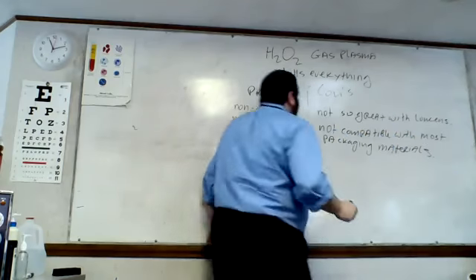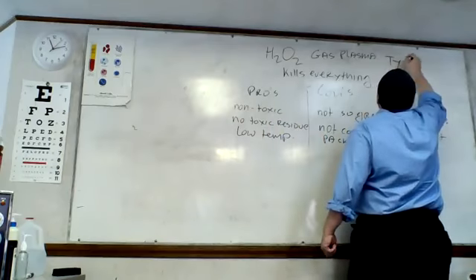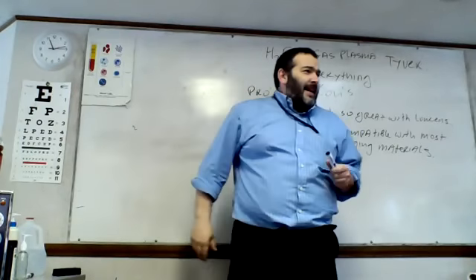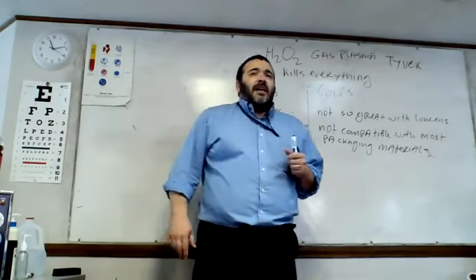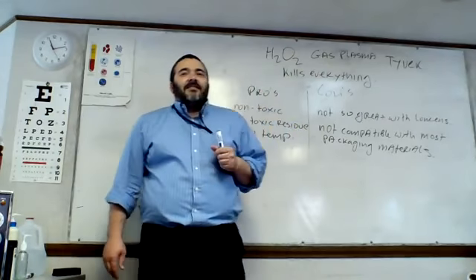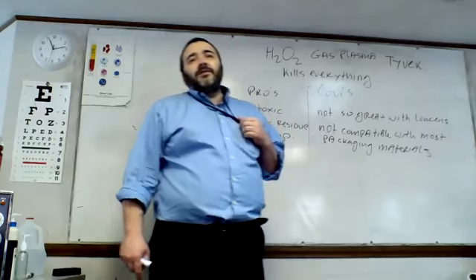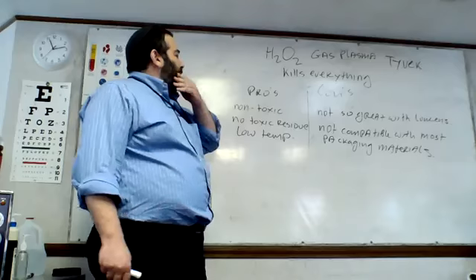In reality, the packaging material that it likes is something called Tyvek. You've seen houses being built, they wrap them up in this white material, it says Tyvek, Tyvek, Tyvek. Well, Tyvek is a brand name of the DuPont Corporation. God bless them. They do a lot of good stuff. A little bad stuff. But Tyvek is the packaging material of choice for hydrogen peroxide or gas plasma.